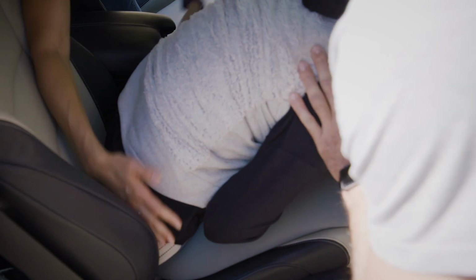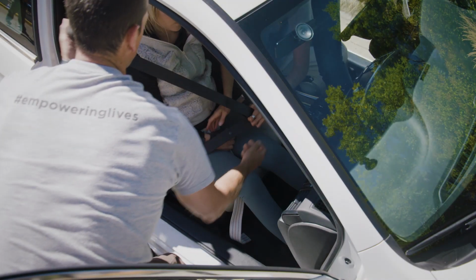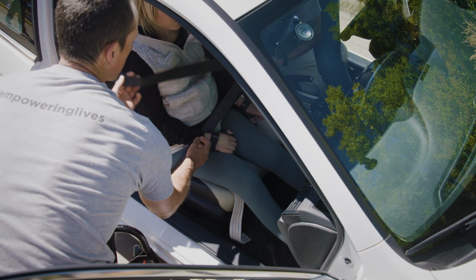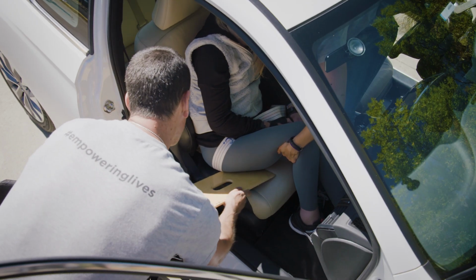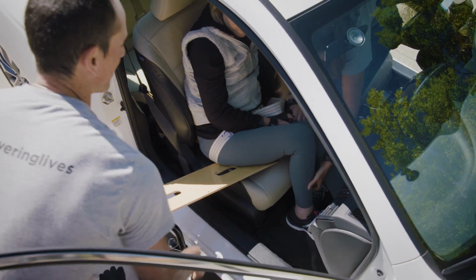Ensure the pelvis is positioned properly. Be sure to fasten the seatbelt. Upon exit, the roles of the assistants are reversed. First, place one or both feet outside the vehicle.